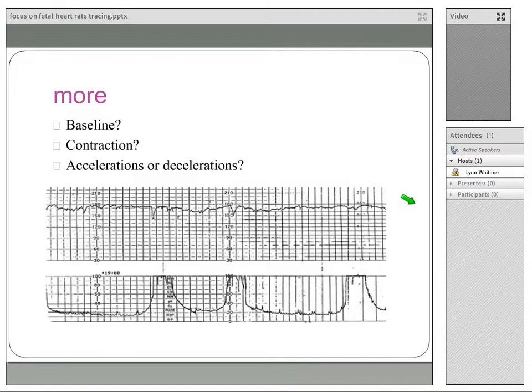How do I respond to this? How do we respond to anybody with a fever? Well, we give them more fluids to try and improve perfusion. If that doesn't work, we're going to change her position. If that doesn't work, then we're going to treat the fever. Give her some Tylenol, and then perhaps we'll need to start some antibiotics. But we need to note what we think this might be. So we have to have a historical picture. We've got to look back at the past fetal monitor strip and be watching what's coming up behind us. So we noted that the baseline is 170.